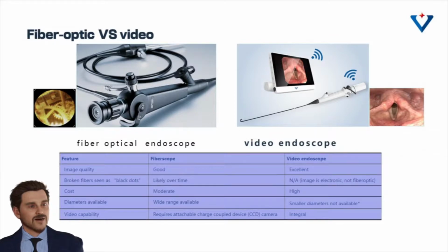If your fiber optic probe is damaged enough to render it useless, you might have to rebuild the entire unit. Generally, the cost of such a repair job is over 50% of what you originally got the device for. Needless to say, it will be anything but cheap.